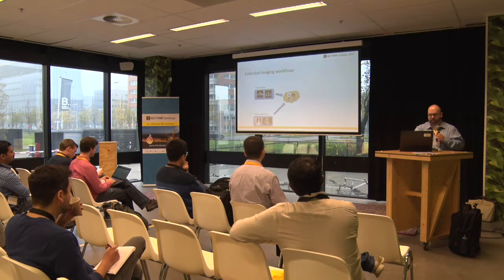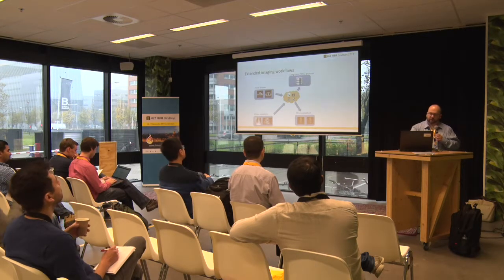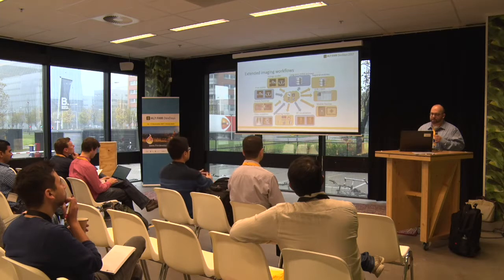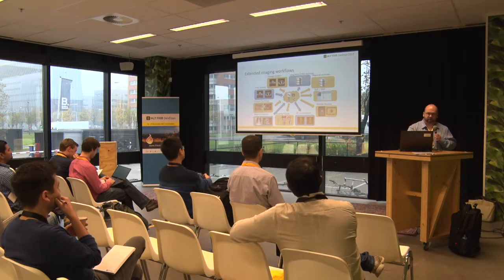We can bring in prior studies, bring in images from other modalities, store them in vendor-neutral archives. We can visualize them with 3D software. We can bring in images from other organizations, from other departments, and we can store them in regional or jurisdictional or national archives, embed them inside of EMRs, and use them on mobile devices, as well as share them in things like PatientsLikeMe and things like this.